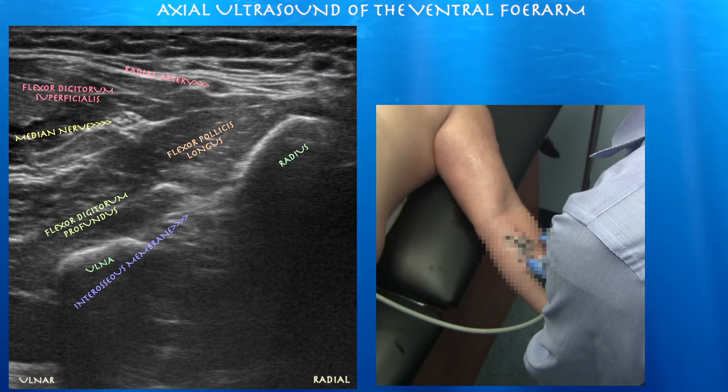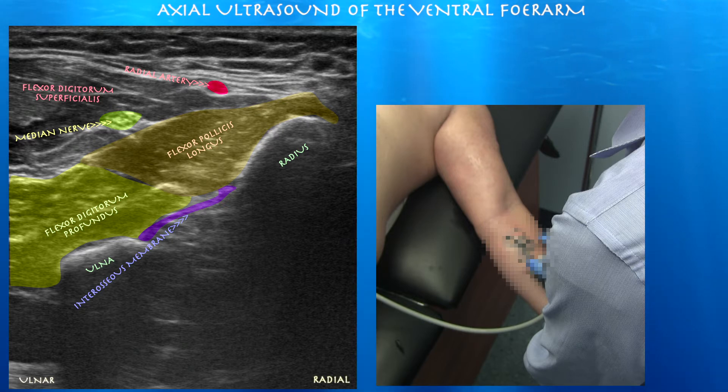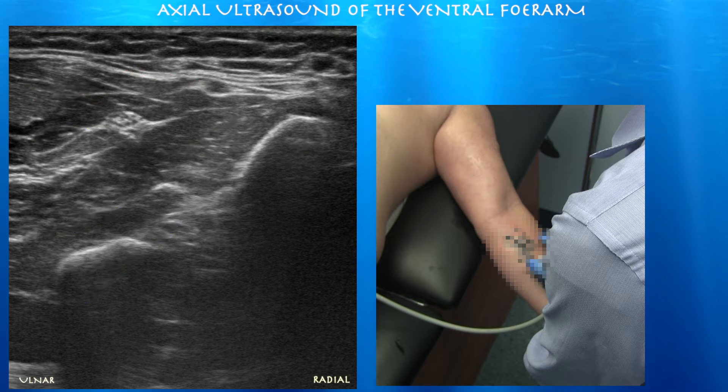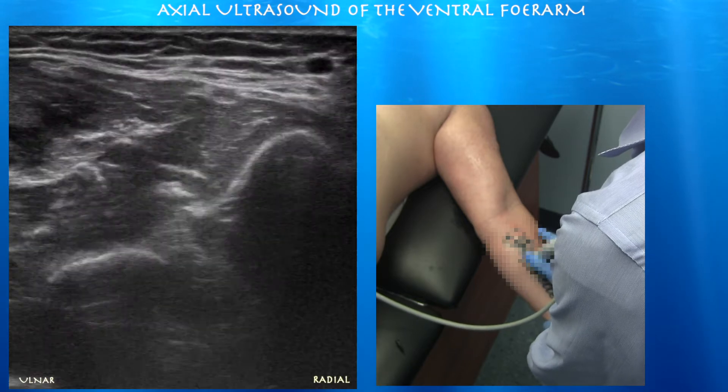Here you can see a fair amount of structures. You can see the median nerve between the flexor digitorum superficialis and profundus muscles, as well as between the flexor pollicis on this muscle.